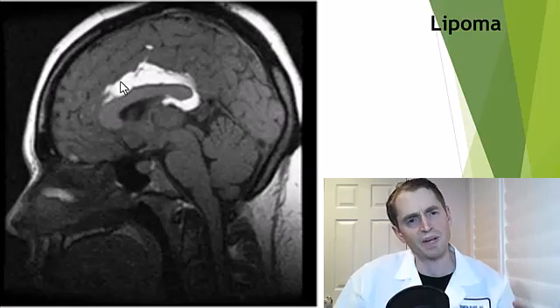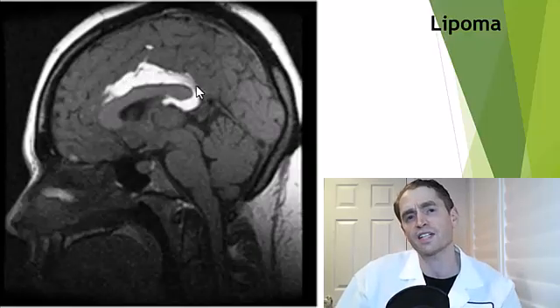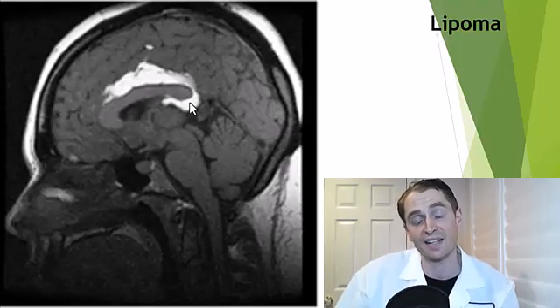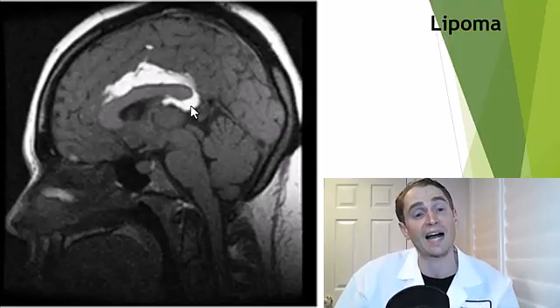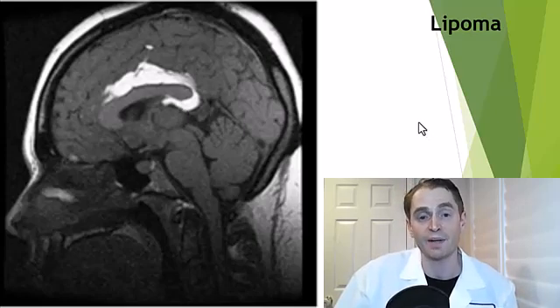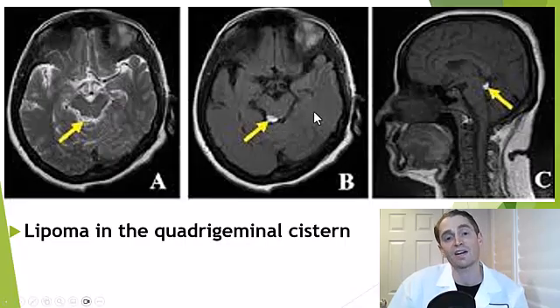This midline structure surrounding the corpus callosum is very T1 bright, just like subcutaneous fat, because it is fat. This is a benign lipoma — a very common location at the midline. You can also get them posterior to the midbrain in the area of the quadrigeminal cistern.